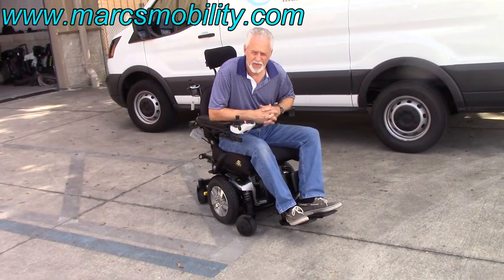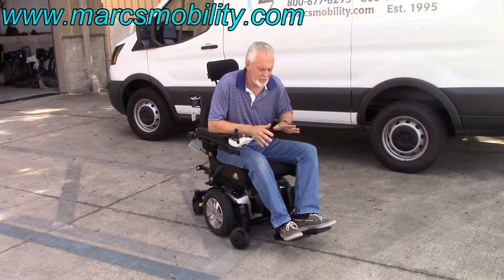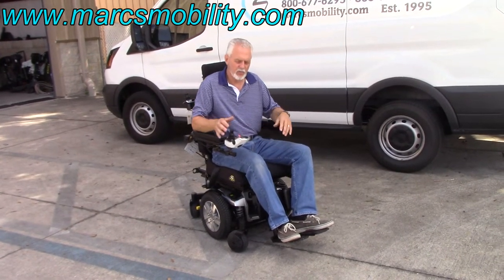Q6 Edge: electric tilt, electric recline, electric legs, six miles per hour top speed, great suspension, new condition, ready to go.